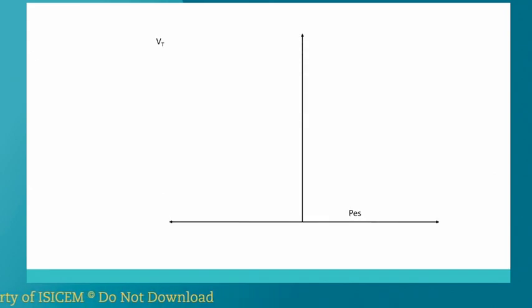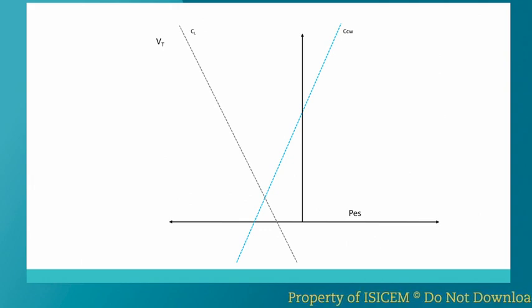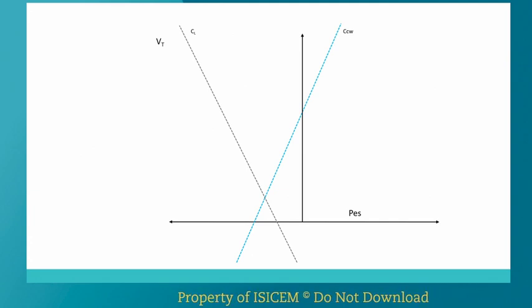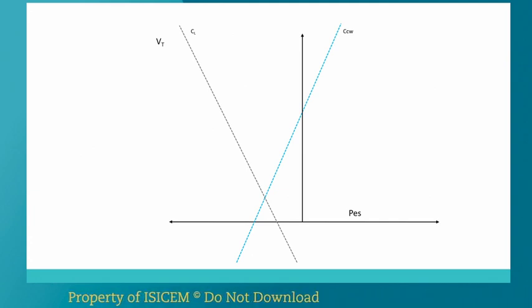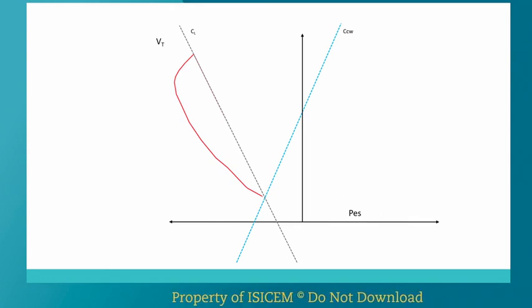You can do some other, maybe fancier, measurements with the esophageal balloon as well, and you can quantify the work of breathing. This is not directly related to the lung distending pressure, but it does give us an idea of how the work of breathing can be divided and which specific component of resistance to volume entry into the lungs is dissipated, or how much pressure is applied to overcome each of these components. And this is what's called a Campbell diagram, which you can derive using some specific software or just making some extra math, not at the bedside, but probably you need some offline analysis, where you'll calculate the chest wall compliance, which you can estimate or actually measure if you could measure the patient's conditions under paralysis, and the compliance of the lung, and this being FRC, the point where both lines intercept.